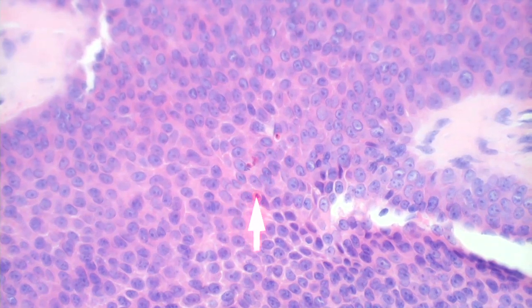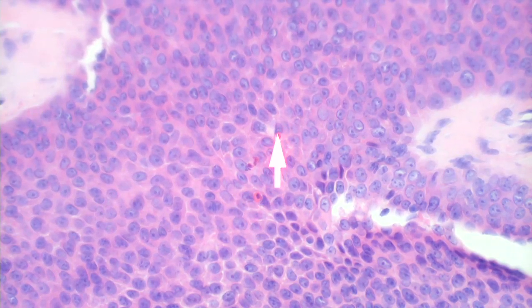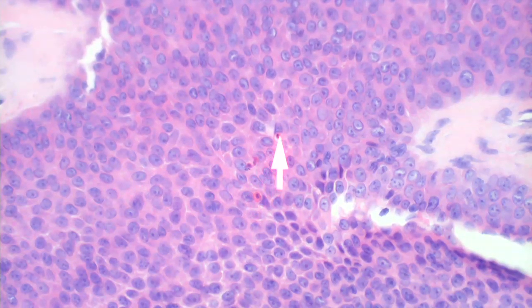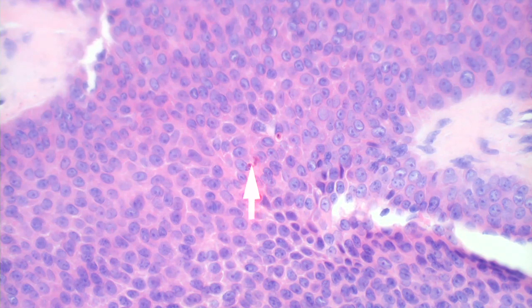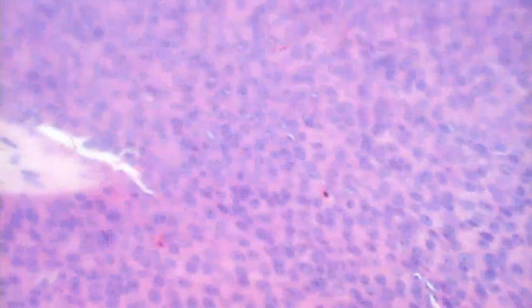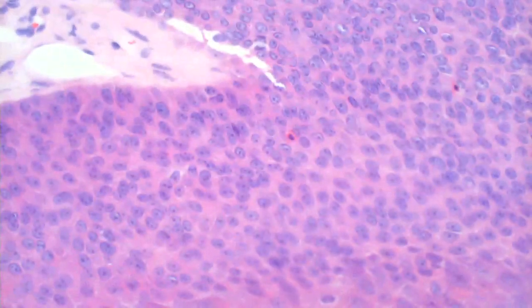So what is that a sign of? Possibly maybe further differentiation or. Well, the cells are dying. So you get like some individually necrotic keratinocytes in this thing. And poroid lesions like poroma, poroid hidradenoma, they not uncommonly get little zones of necrosis in them.